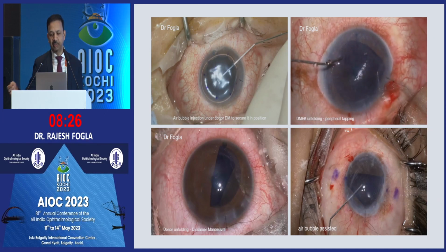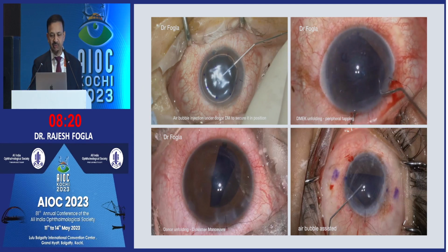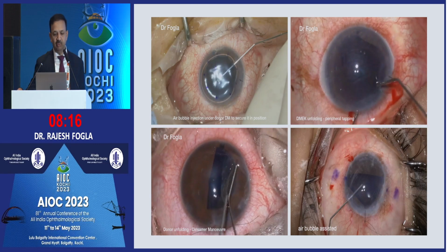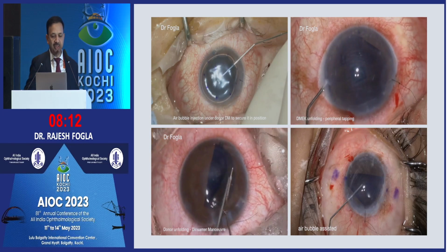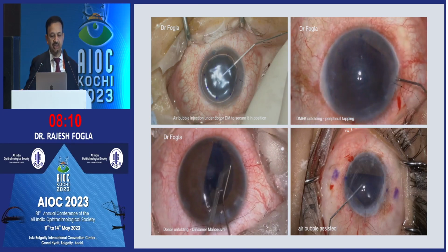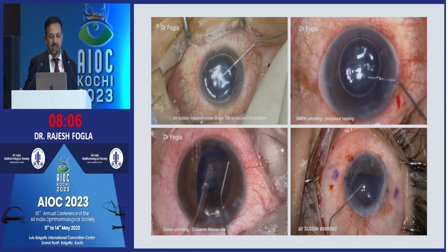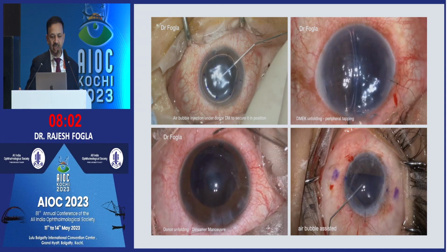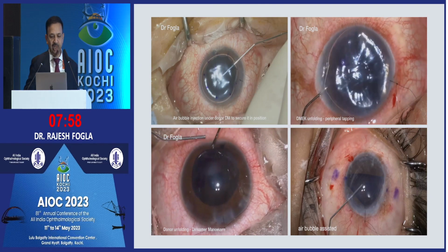If you have a paracentesis, you can even release fluid from that paracentesis to allow the scroll to open up with the movement of the fluid. Younger donors, which have a greater elasticity, may not open up by pressing outside. Then you have to press inside the scroll. So that's called the Dirisamer maneuver, where you are fixing one edge of the scroll with your cannula, and with the other one you're doing a carpet unrolling technique or the drum roll technique, where you push the scroll with the shaft of the cannula and get it to open.